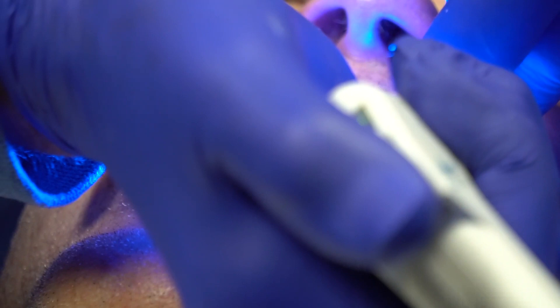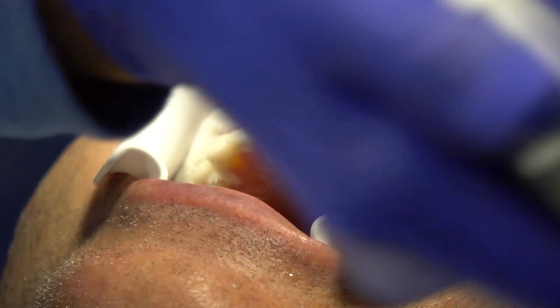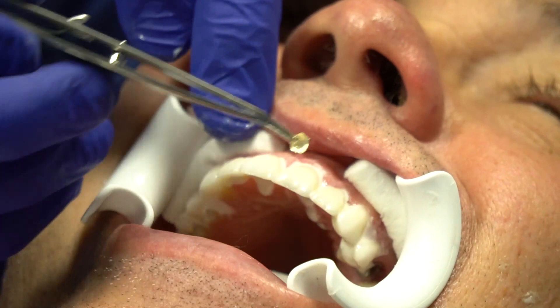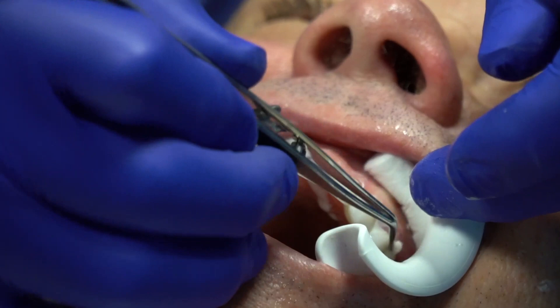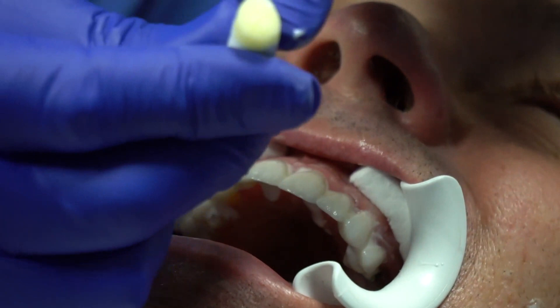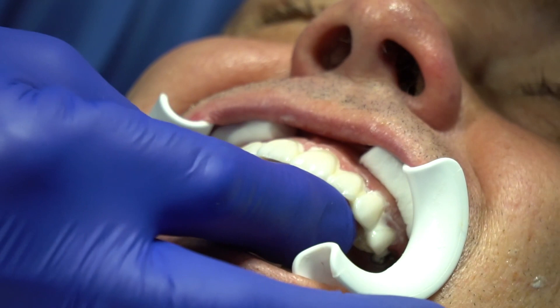Now we're going to start talking about cleaning up the excess. You can use one of these dabbing things, a 2x2, or some people will floss at this point. Sometimes I'll just take a cotton roll on the lingual with a little resin in it and go on the inside and wipe all the excess away, since we have decent margins here.